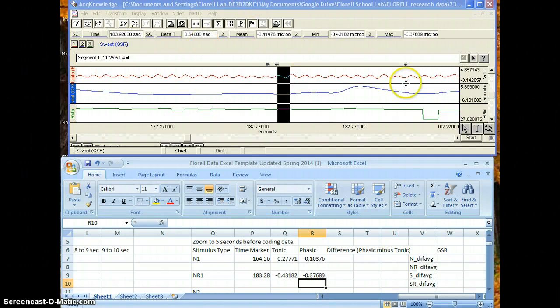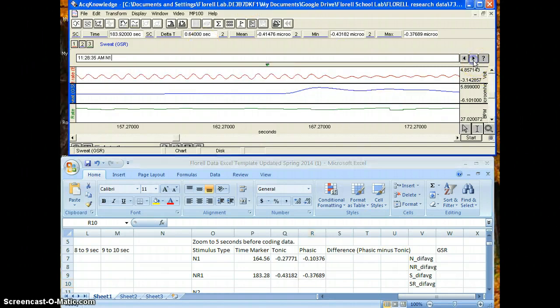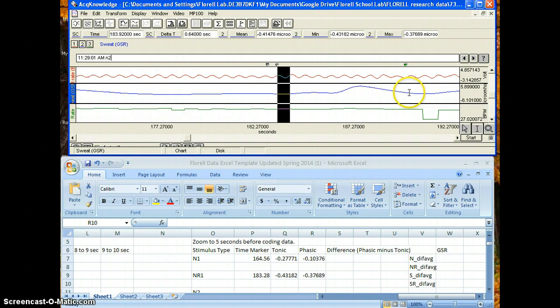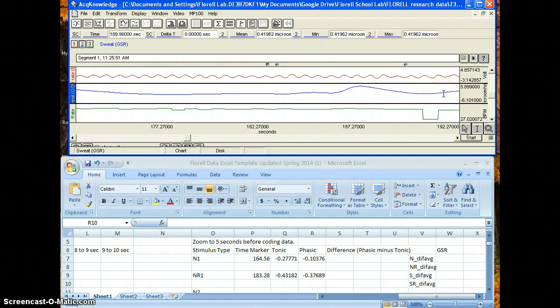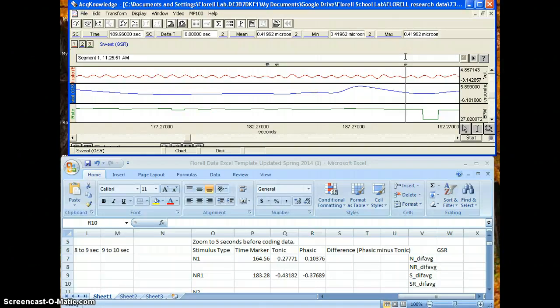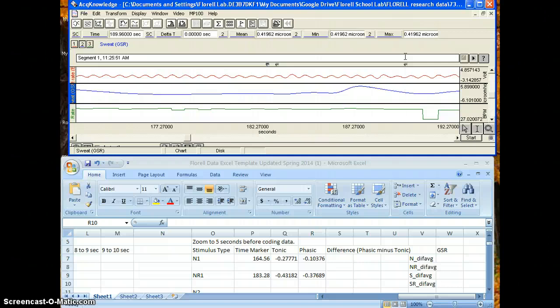But here's a good example. So when we go to N2, which is right here, you don't analyze this one at all because do you see that there's a huge dip here? If the GSR is not flat at the time marker, then the data for that time marker cannot be used.